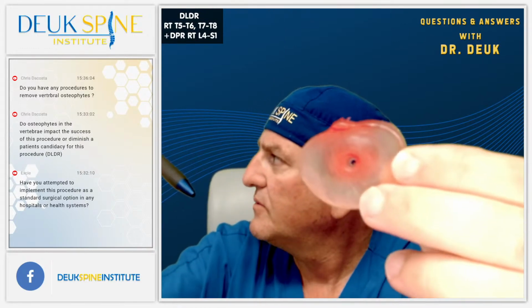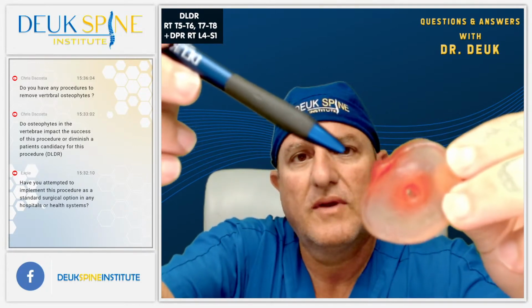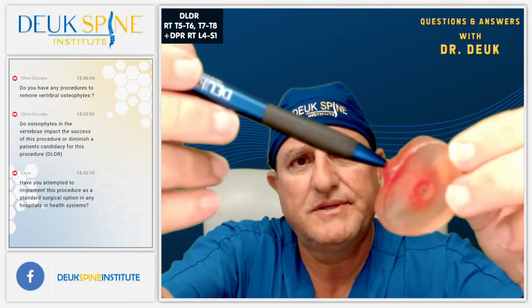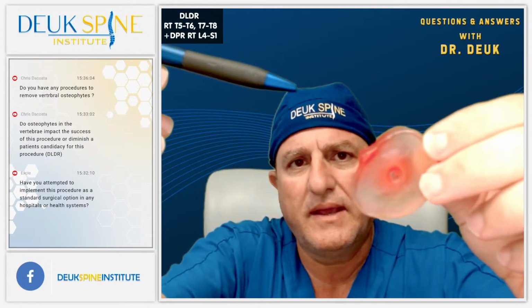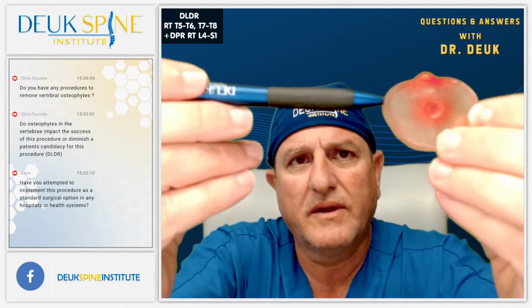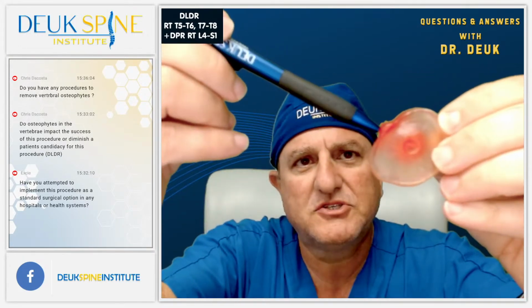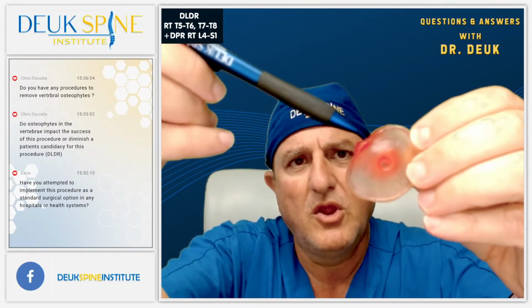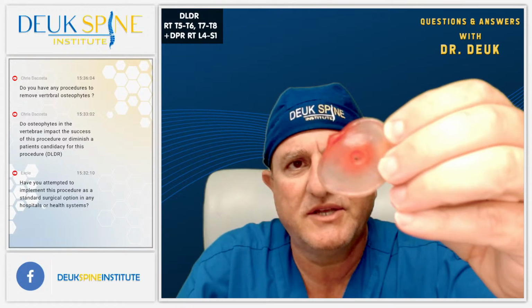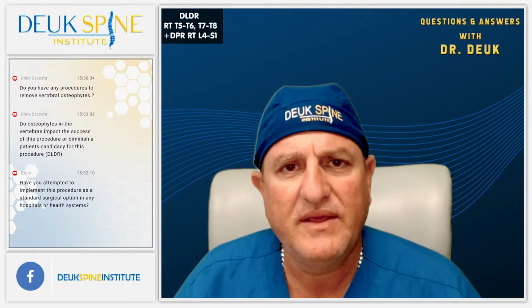So what we do with the DLDR is we actually come in right through the herniation and the tear. So this area is damaged already. We're not going through a normal area of the disc to fix this. We're going through the damaged area all the way in, and then we're pulling out. As we come out, we zap and clean up the herniation. So the answer is no, we're not damaging in any way the disc.